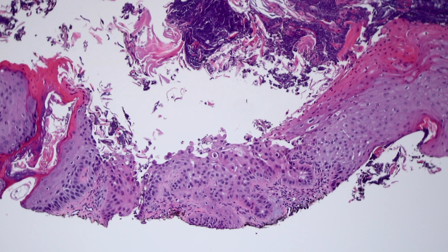I know that what's here doesn't really meet criteria in my mind for in situ squamous cell carcinoma. Looks like actinic keratosis, but I've got a thin transected shave that's not showing me what's happening below. So then that gives my dermatology colleagues the option of either, if they're worried about it, they can go back and do more. Otherwise, they can follow it and watch, and if the lesion persists or grows back, then they can go and biopsy it again or do something more definitive.